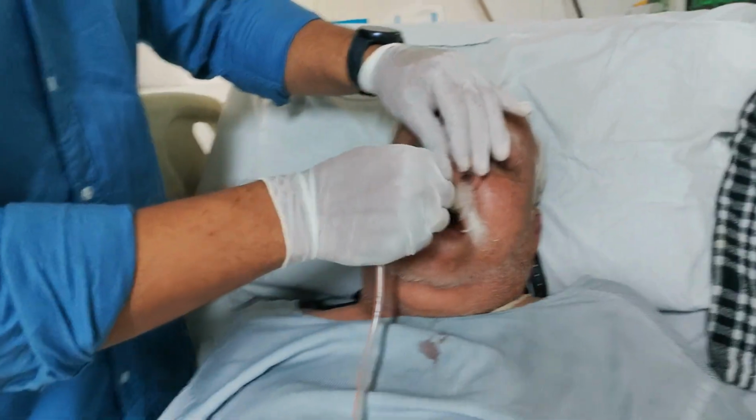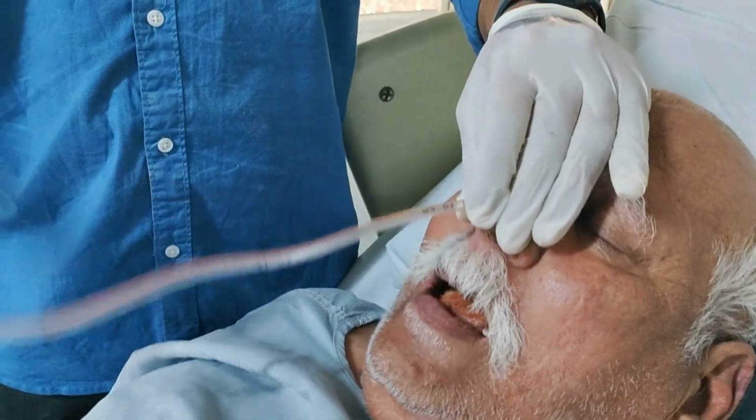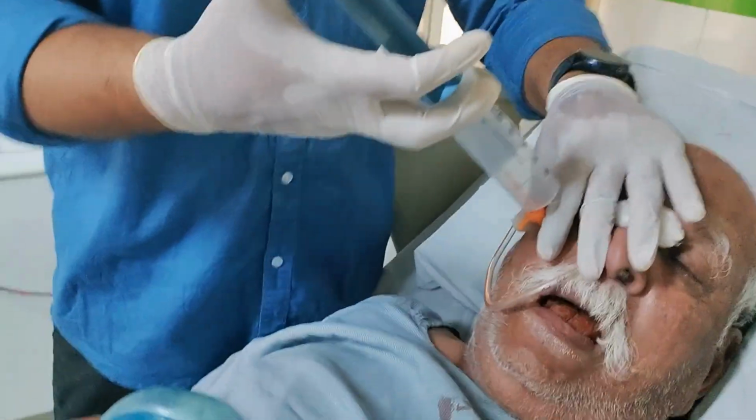Once the tube is fully inserted, it's crucial to confirm that it's in the stomach and not in the lungs. You can do this in one of two ways. First, you can aspirate gastric contents using a syringe. If you get gastric fluid, you're in the right place.